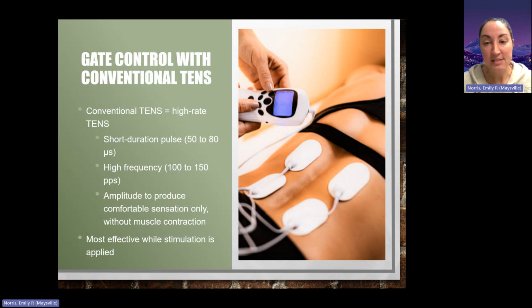The only lasting benefit that it can produce is it can interrupt the spasm pain cycle. So there is a cycle of when people are in pain, their muscles get tight, more guarded, and could spasm, which causes more pain. And then it just continues that cycle. So if the pain is decreased, then it can also decrease the muscle spasms and then that painful cycle, which would be one lasting benefit. Otherwise, it primarily only benefits the patient while it's being worn.